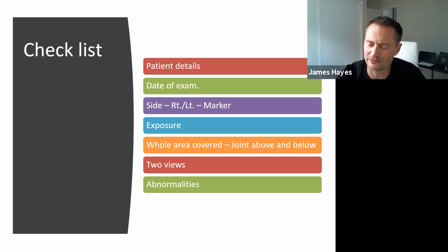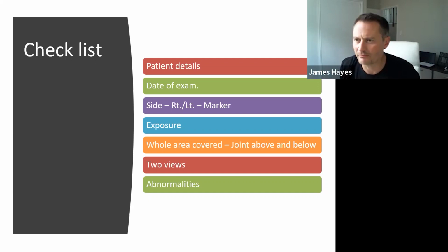So you've got Mr. Jones in bed 3 or something, and you're looking at his chest x-ray, blah, blah, blah. And you're like, okay, well, I'm just going to have a quick look at one of the tubes that the patient had inserted. And you turn around to do something completely different. In the meantime, one of your colleagues comes in and has a look at a very similar image, okay? So that's now on the screen, and they walk away. You haven't seen them. Now, it sounds like I'm over-explaining this, but I've done it myself, and it's not like I'm not able to make mistakes, okay?